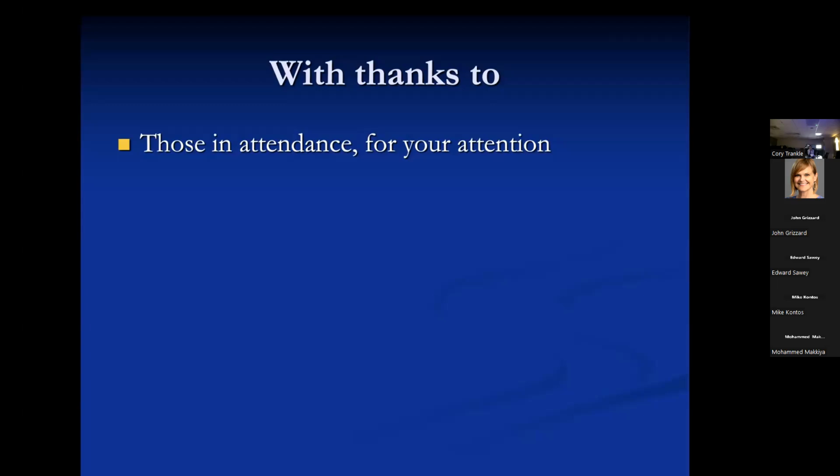Sure. And so I think we're talking more about endocarditis, right? But I get what you're saying, and you're exactly right. So that's a really good point. I'm really glad you brought that up, because it illustrates the fact that the way MR usually works is that you're building an image up from multiple repetitive heartbeats. And so the presumption is that at any given phase of the cardiac cycle, let's say, the anterior mitral valve leaflet will be in roughly the same place at any given point in the ECG cycle. If that is not true, if you have chaotic movement, then all bets are off.